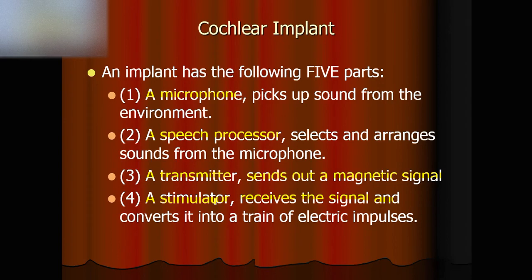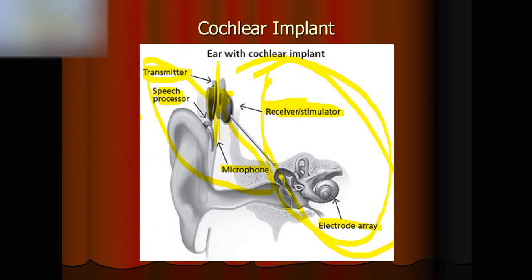But how much current, how much amplitude of the impulses should the stimulator generate? That's the key part. How much? So how much amplitude, and how frequent is the periodicity of the electric impulses?